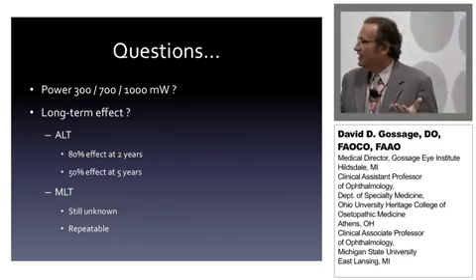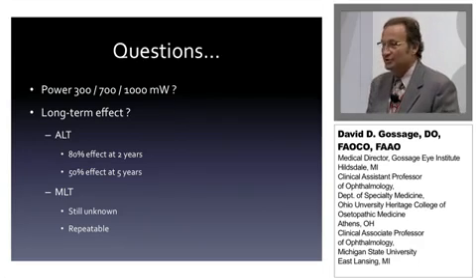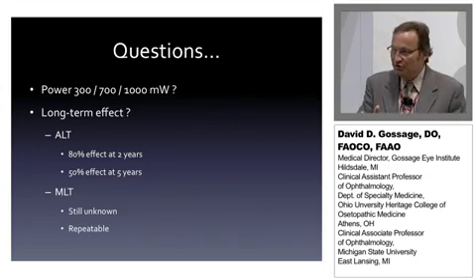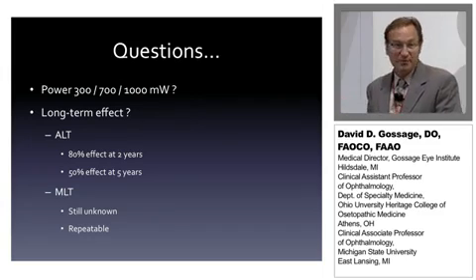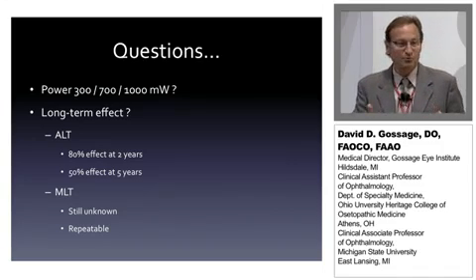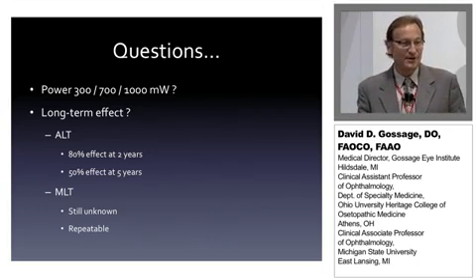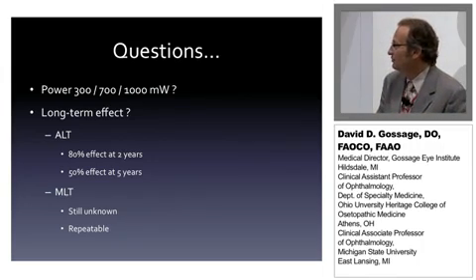So the questions we had were, what's the best power to use? Is it 300, 700, or 1,000? I think overall, probably starting with around 700. Some people use 600 or so, but I think the 700 power to start with is probably a good number. I may change my mind once I see more results back of the 1,000, and I may increase it a little bit. Or the question is, do we prime the pump using 700 and then hit them with 1,000 afterwards, and we see even more effect? I don't know. So this is going to be all kind of interesting things that we're going to learn about this laser down the road.